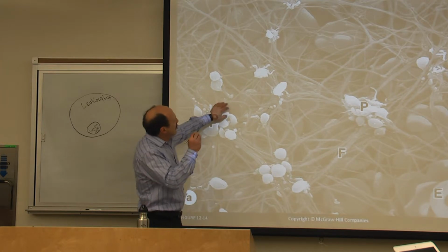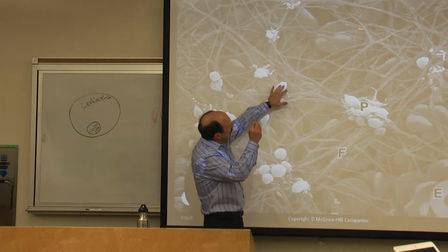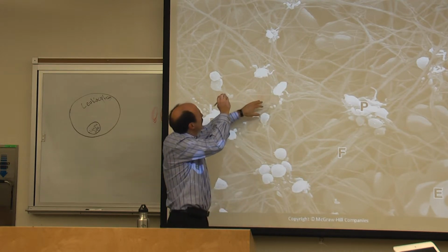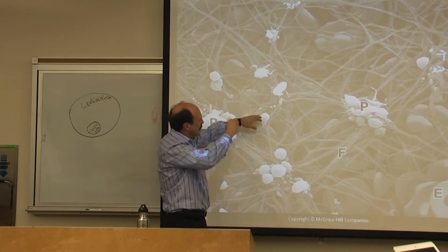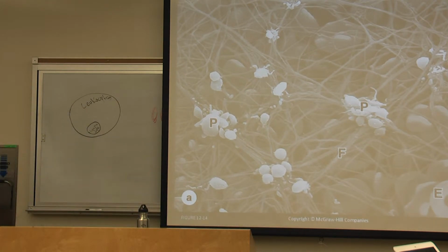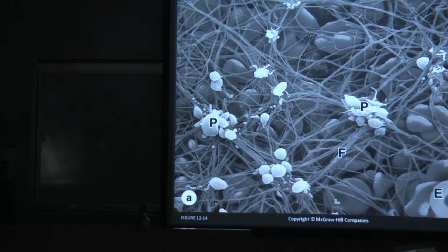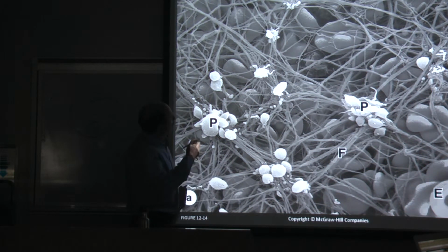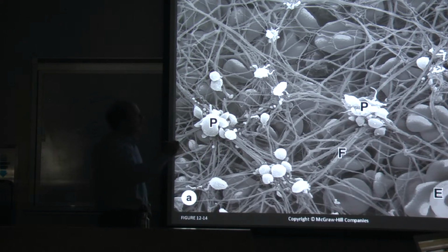What you see here, the round things, are like cells back in there. It's probably some views of some red blood cells, because that's mostly what's in blood. All these gray things. Kind of a spectacular picture, I think. Very visual. So you see the erythrocytes, red blood cells here, and these are the platelets. And you see that the platelets have a very important role in getting the blood clot to form.